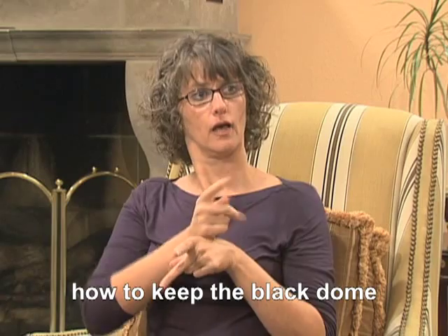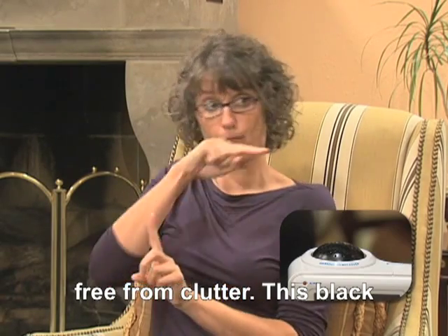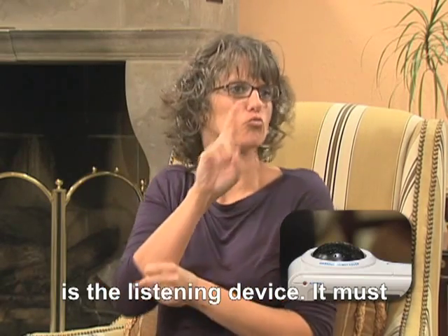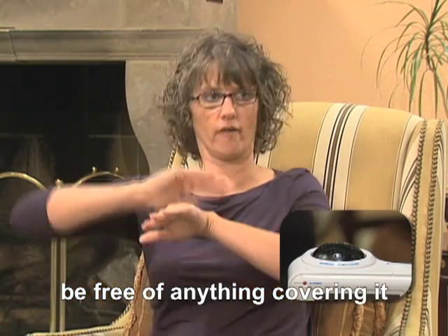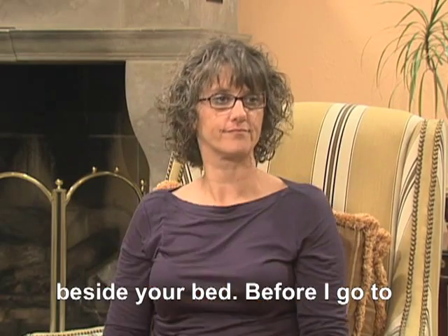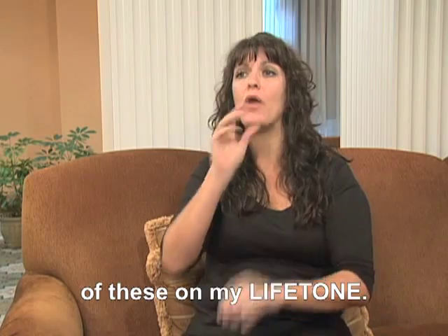Let me show you how to keep the black dome free from clutter. This black dome on top of the Lifetone is the listening device. It must be free from anything covering it, like a tissue or a magazine or other clutter you might have beside your bed. Before I go to sleep, I always have a book or a magazine on my nightstand. I will make sure I don't put any of these on my Lifetone.